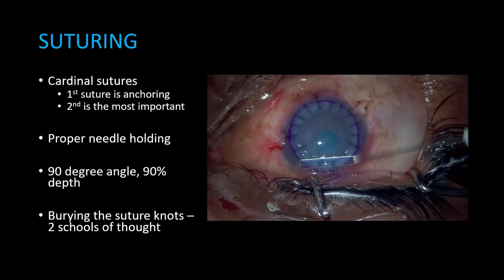So before all of this happens, you need to make sure that there is adequate block administered to the patient, preferably a facial as well as a peribulbar block. Make sure the patient has had IV mannitol or oral glycerol if systemic conditions permit it, because you're only going to be as comfortable as the patient on your table. Otherwise, the surgery is going to be hell.